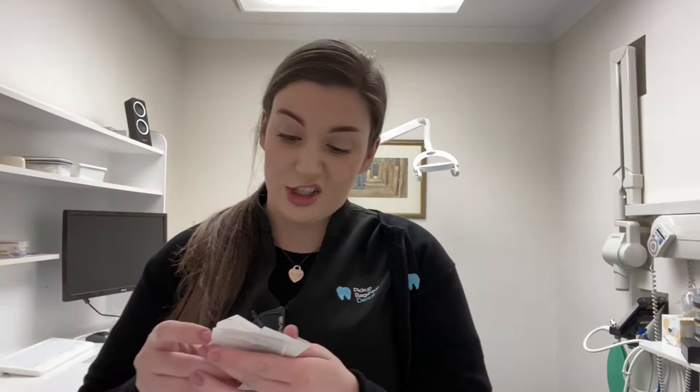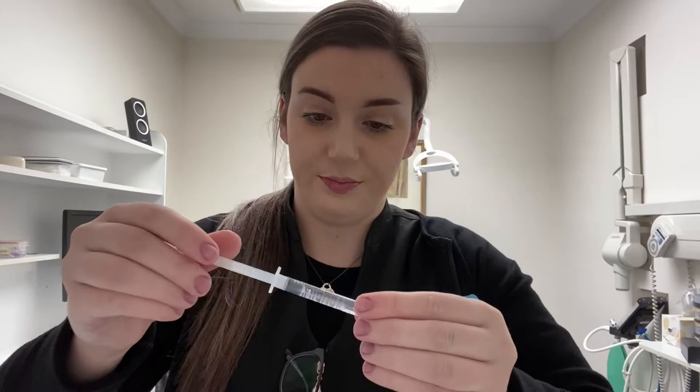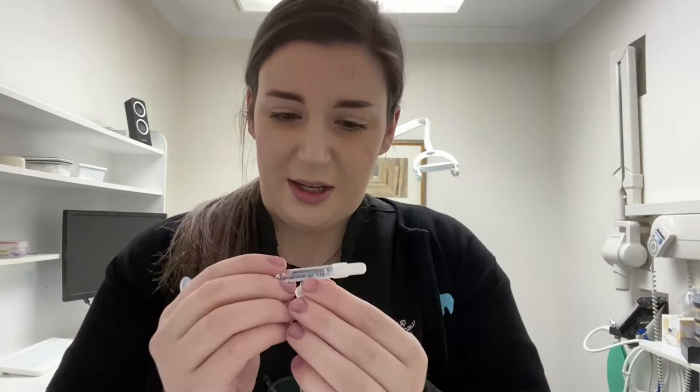I'll show you how to do that now. Inside the whitening kit, the Poladay Whitening Gel comes with instructions for use and also a nifty chart so you can see your teeth colour. I'm going to start by getting the hydrogen peroxide gel — it comes in a syringe like this. On the side there are little measurement lines, which is a great system to see how much whitening gel you need, because you really don't need much at all — a little goes a long way. It also comes with little tips that you put on top of the syringe.